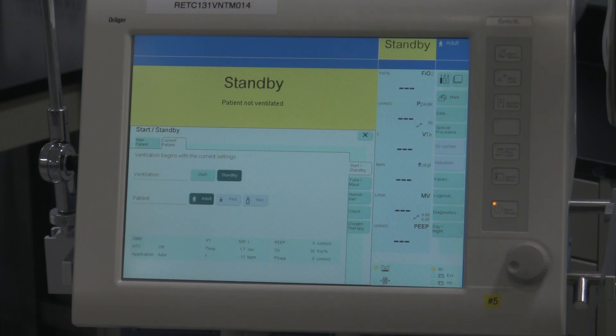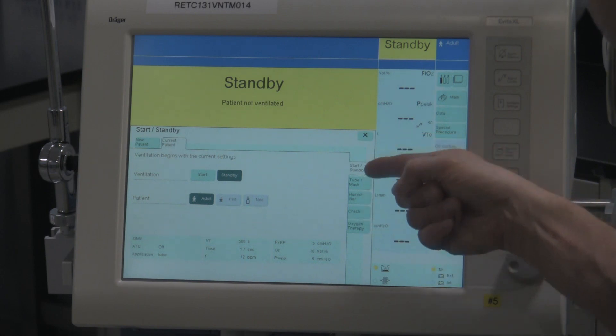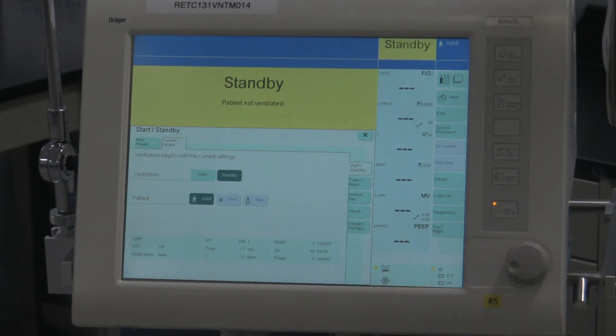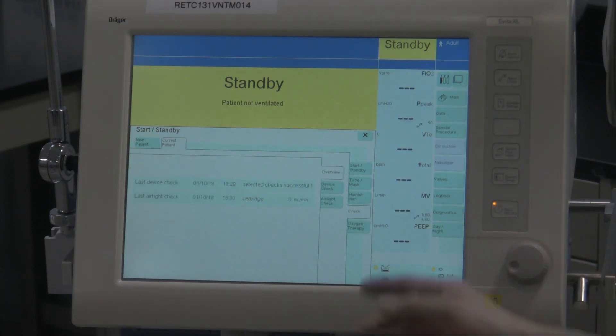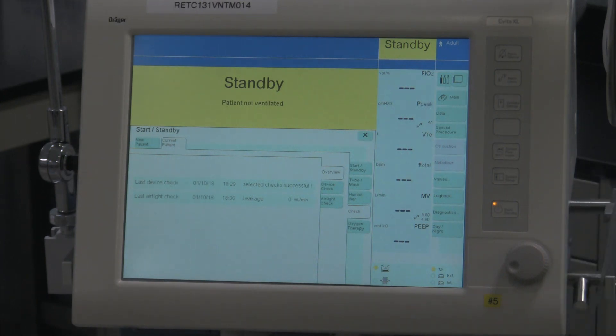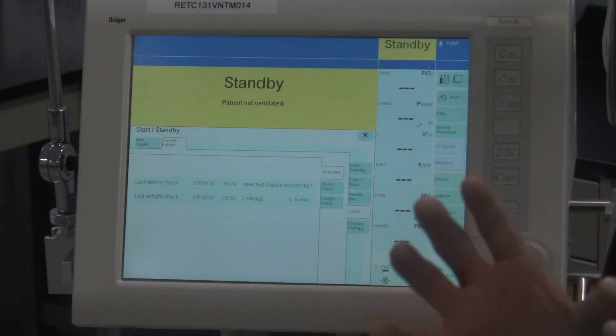So now how do you do the device check? Well, on the ventilator, in this menu, there's a bunch of these drop-down tabs right over here. And the one you're looking for says 'Check.' That stands for the device check for doing the pre-use check on the ventilator. So we're going to activate this tab, and then it brings up a couple of sub-tabs. What we want to do is the device check. There are two of them here: the device check and the airtight check — they're two separate tests.